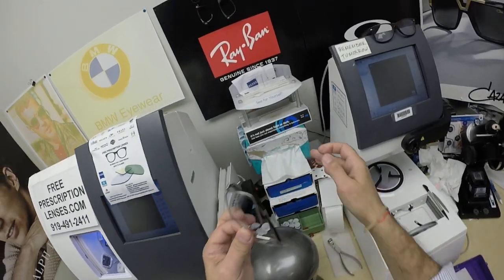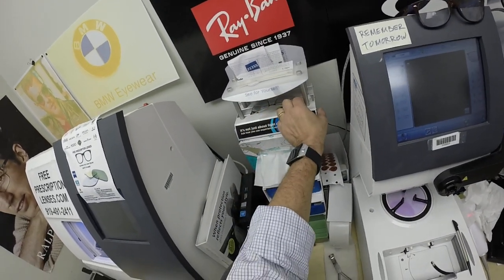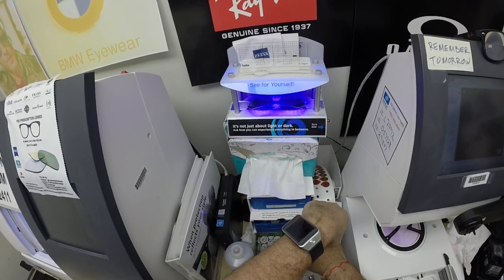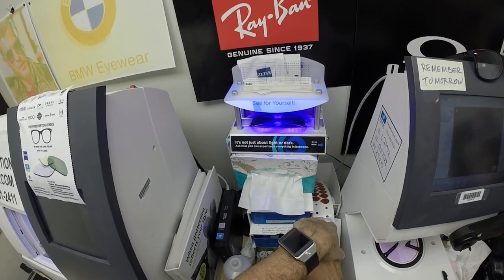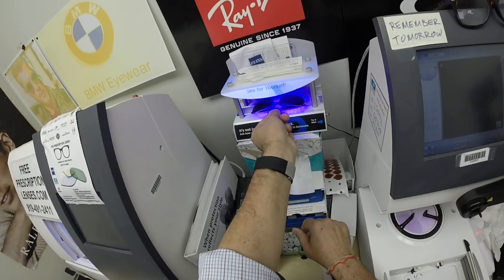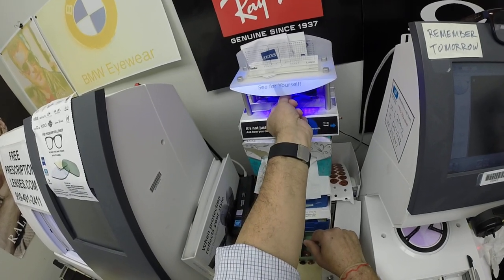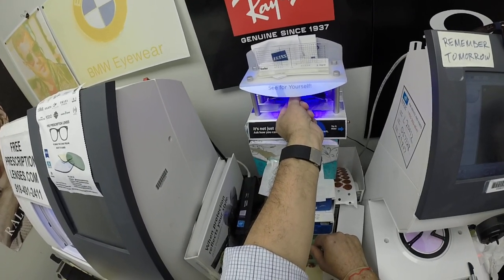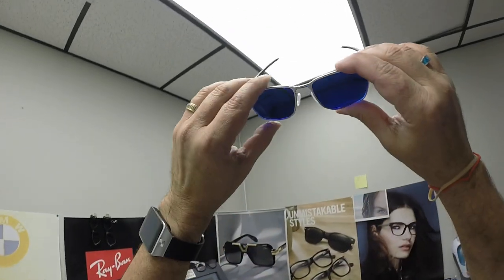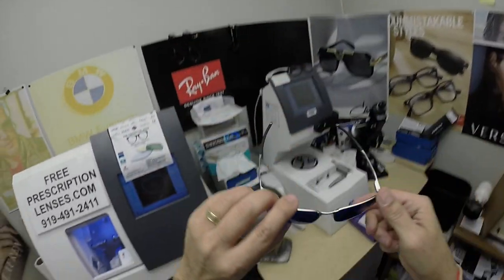I also apologize for repeating myself, because some people may be seeing this for the first time. All photochromic lenses will turn dark on day one and continue to darken every day for the first couple of weeks of sun exposure. After that, they'll work for years at maximum performance. The only time they won't work perfectly is if you're behind the windshield of a car — your windshield absorbs the sun's harmful ultraviolet rays. Look at how cool that looks!